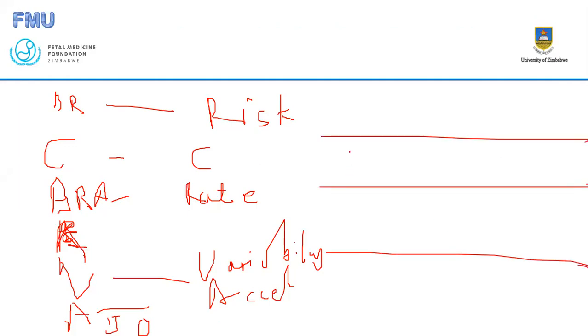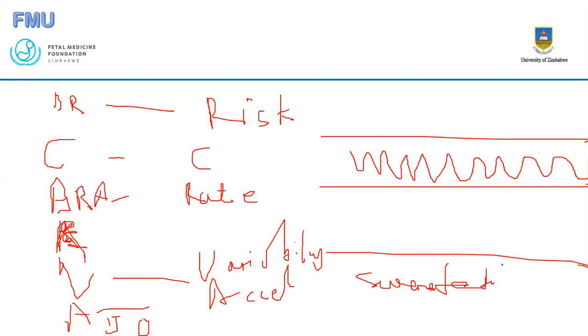The sinusoidal pattern is this kind of tracing that will be almost like this. It is a smooth tracing. It is a feature of severe fetal anemia. When delivery is not imminent, these babies will need to be offered cesarean. We are going to see fetal anemia in conditions such as fetal-maternal hemorrhage, which may occur from unknown causes. We may also see it in women who are isoimmunized. This is not common in our setting. We have not come across a woman who is isoimmunized to date. But we may see this in babies with TAPS as well, twin anemia-polycythemia sequence. You may see this kind of tracing.